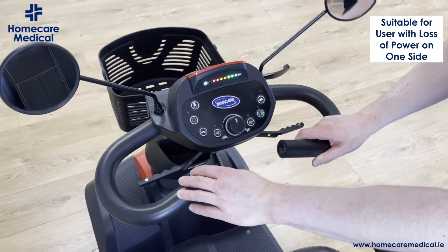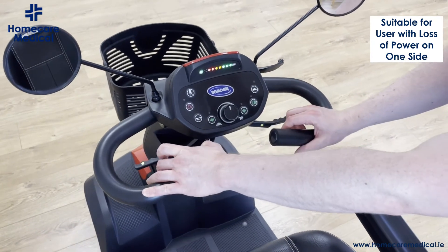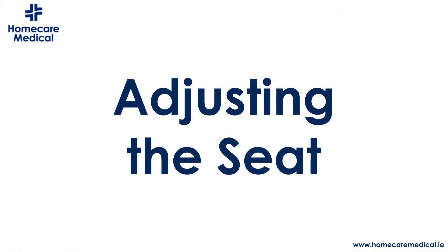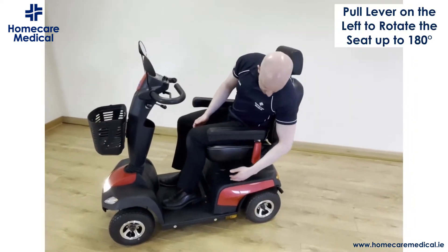The Orion features reverse control, so you can do the same thing on the left hand side, but just to accelerate you do the opposite — if you push it away it will accelerate, and pull it towards you to reverse.